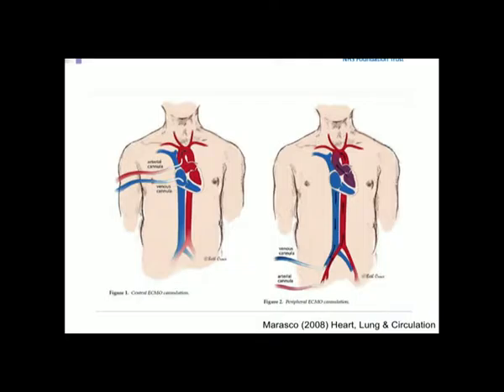We have peripheral ECMO or central ECMO. The surgeons among you will have your clear preferences. What's interesting is that several of the surgeons we work with now are moving towards using peripheral ECMO as their post-cardiotomy tool of choice rather than central. So they're getting the chest closed, getting hemostasis, running heparin-free in that early post-operative period, and using peripheral ECMO as the bridge, which is an interesting approach, and that's been starting to sneak in over the last little while.